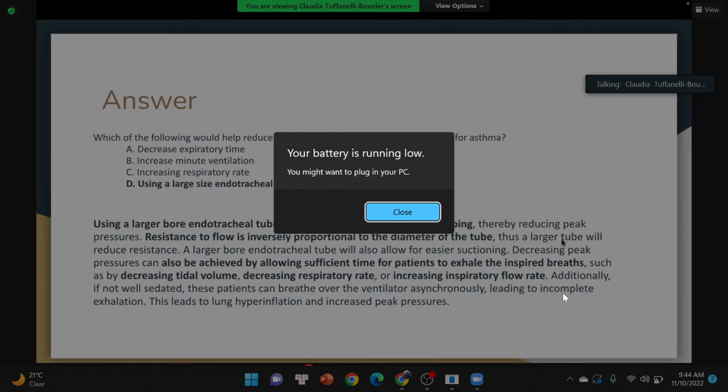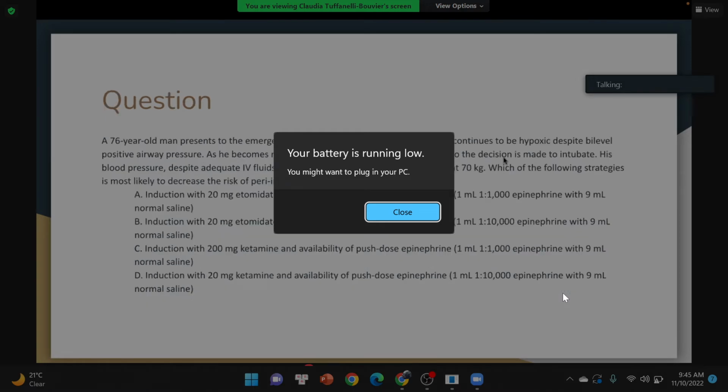And you measure peak pressure with the ventilator, and we'll talk about that a little bit in the 4th lecture. So not next week, but the week after, with complications of intubation and the ventilation, things like that. But this is kind of to harp on the point that the bigger the tube you can get in and pass, the better it is for the patient for a lot of disease processes.